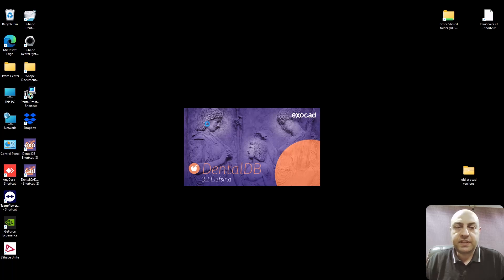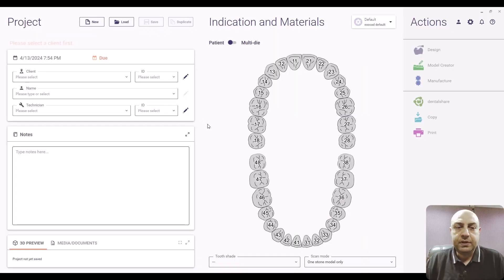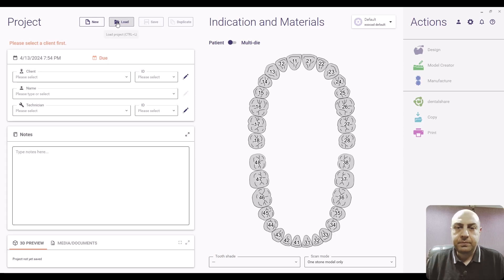Go to the Exocad software, open the database module.